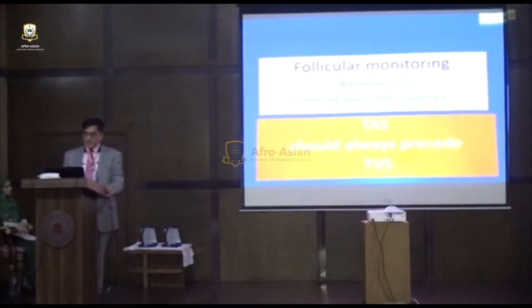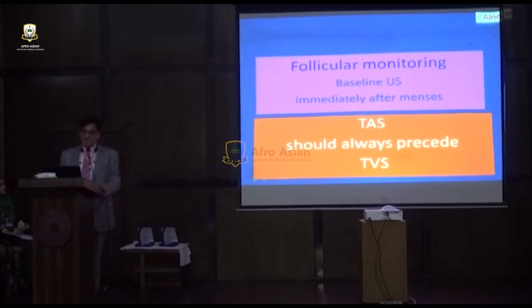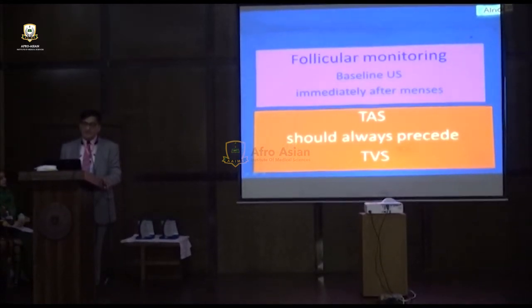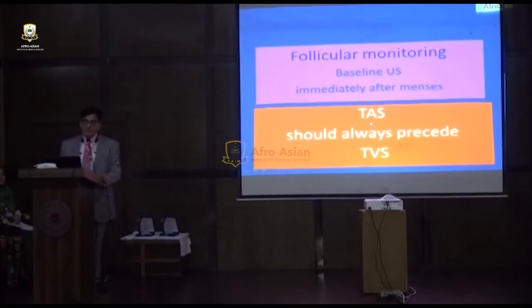Number two, always, always do the transabdominal scan before you start the TVS scan. Never ever immediately start the TVS scan, because there are multiple positions of the ovaries, which I showed you in the next slide. So please always have a full bladder and do the transabdominal. We call that the panoramic view, and the depth of the transabdominal scan is about 20 centimeters.